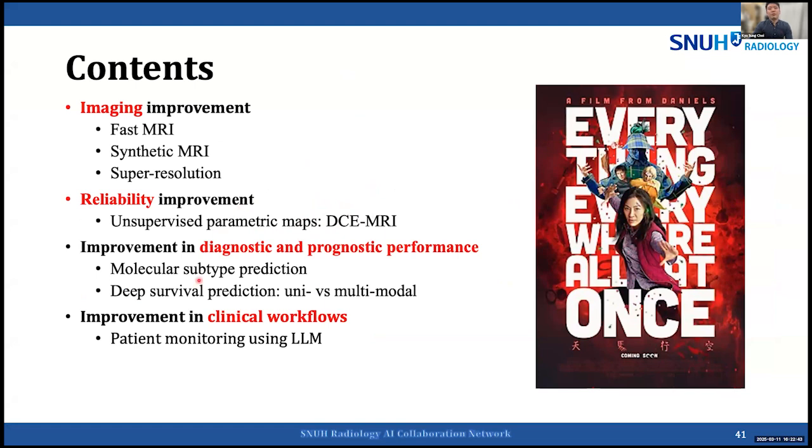Actually, we say that neural networks are generalizable because they have at least 1,000 cases per class for the classification network models. But in clinical practice, that kind of large data set is not usually fulfilled. So especially in the rare brain tumor glioblastoma.